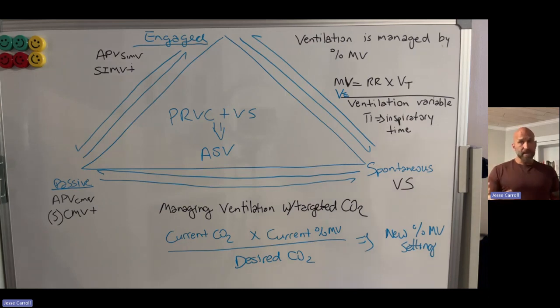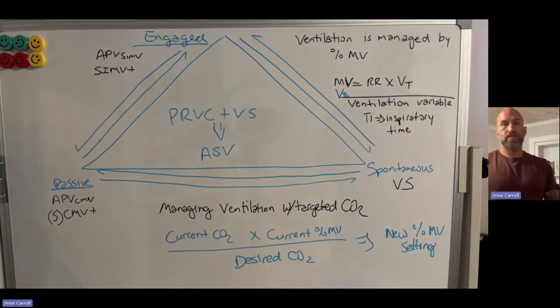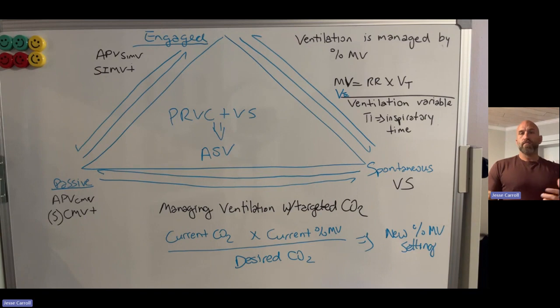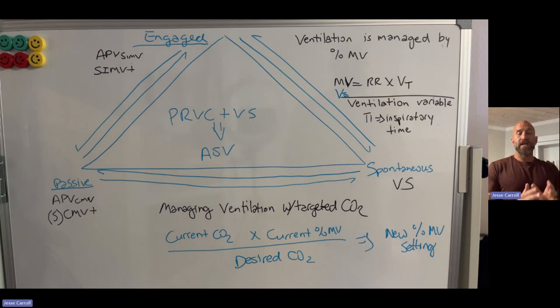So keep in mind, if something dynamically changes in transport, and we're ventilating a patient in some sort of conventional ventilation mode, my medic or my rescuer or anybody who's interacting with the patient is going to have to make an on-the-go decision of which ventilatory change to make to get the best case outcome for my patient, and how do they know that it's not going to dynamically change just a few minutes down the road.